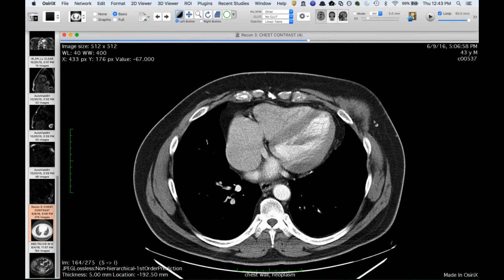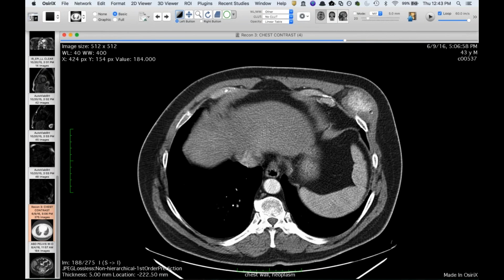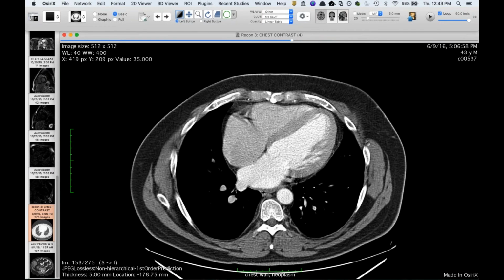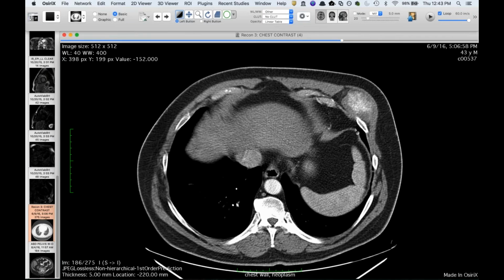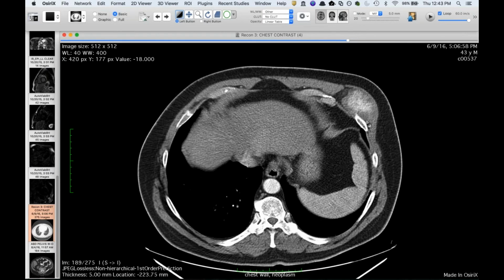I threw out a large differential, even some weird hemangioma or some sort of mesenchymal tumor. I didn't know, but the fact that it hadn't grown was encouraging. They took it out, and it was an angiofibroma, is what they classified this as. And I'll include the pathology report when I can get it downloaded.